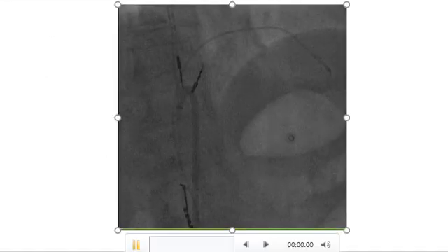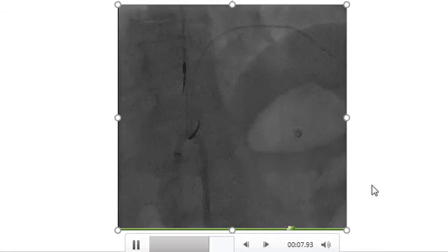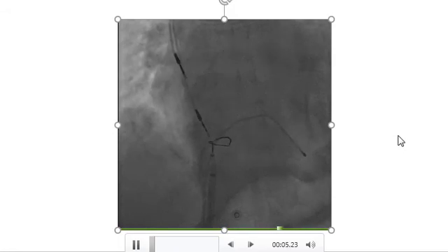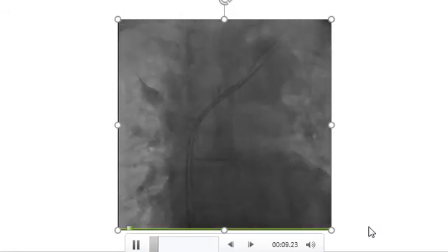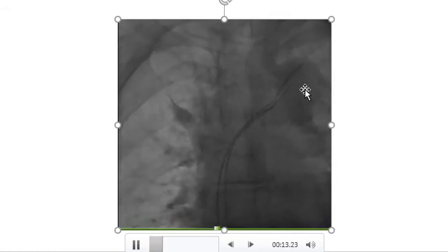The grabbed pacemaker leads were made free from the right atrium and ventricle and extracted to the IVC. After that, each separated lead was snared and extracted within the Agilist sheath, and they were also extracted from the subclavian vein.